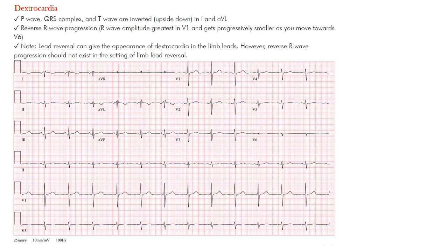So what can we expect to see in dextrocardia? The P wave, as well as the QRS complex and the T waves, are inverted — they're upside down in the lateral limb leads. So here in lead one and AVL, notice that your P waves are negative, your QRS complexes are negative as well in these leads, and your T waves are negative here as well. That's the lateral limb leads — one and AVL.